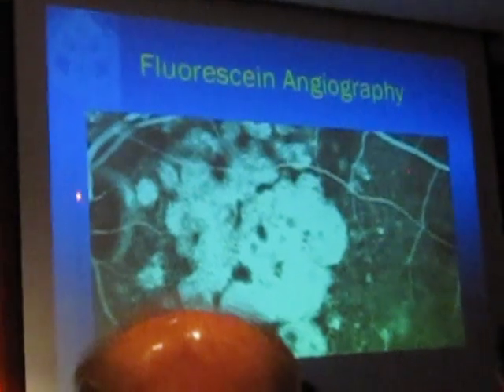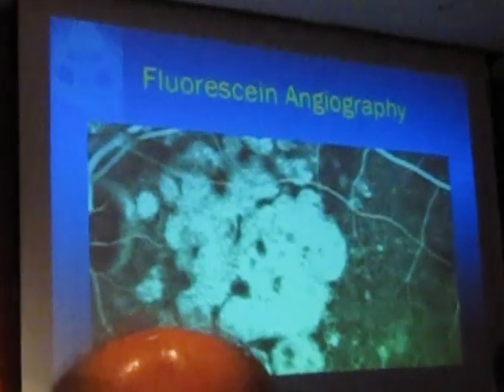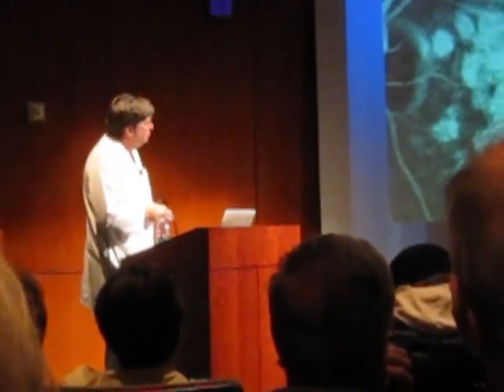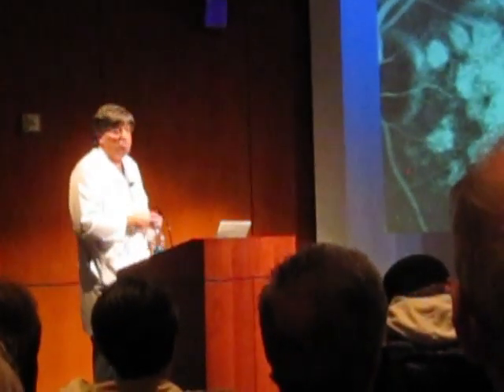We also have something called fluorescein angiography, which we inject sodium fluorescein into the retinal vessels. It stains the retinal vessels and capillaries white and allows us to assess retinal and choroidal vascular perfusion in a very precise way. You'll keep a memory of this eye because this is one of the first patients, in fact, the first patient that we transplanted.